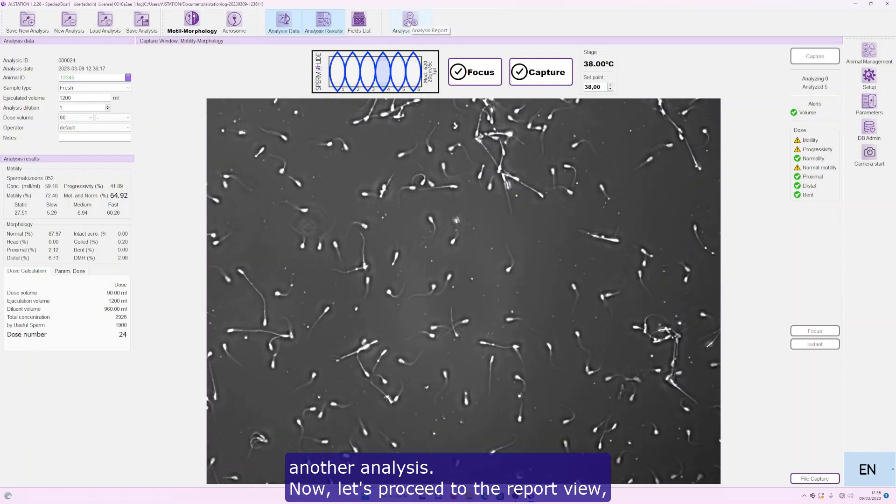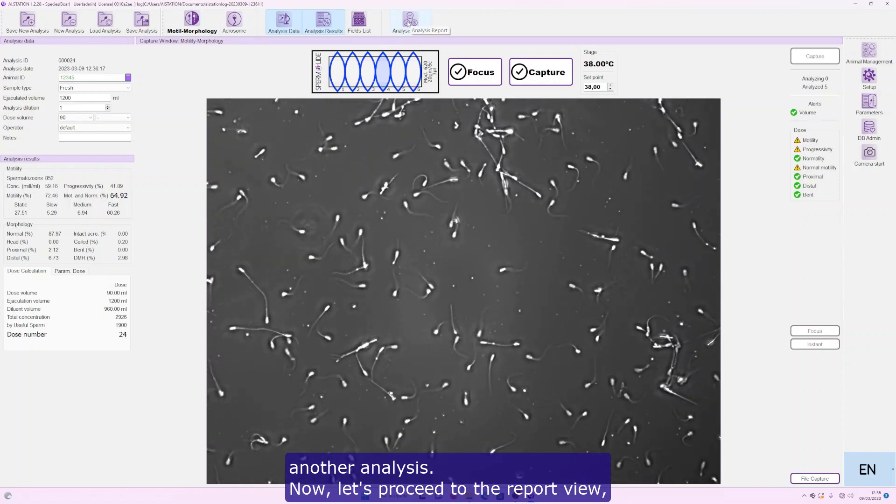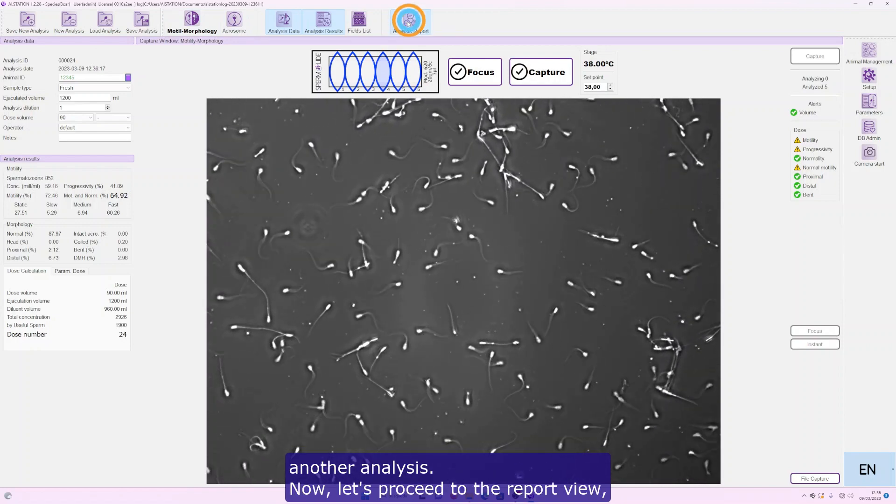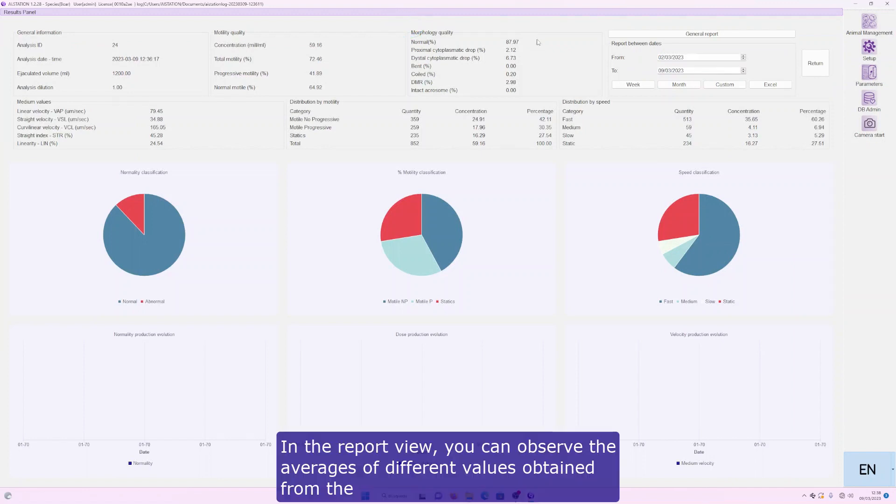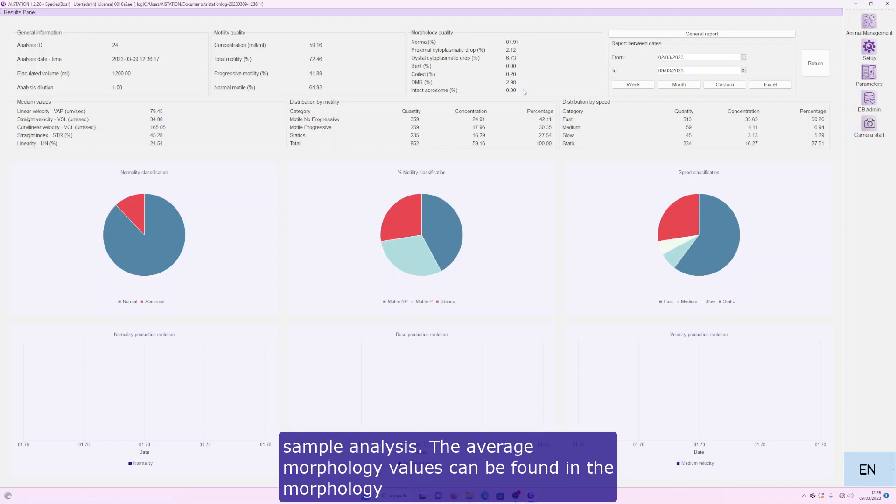Now, let's proceed to the report view, where the analysis results will be presented. In the report view, you can observe the averages of different values obtained from the sample analysis.